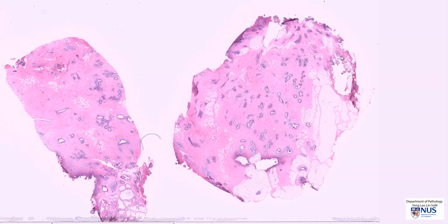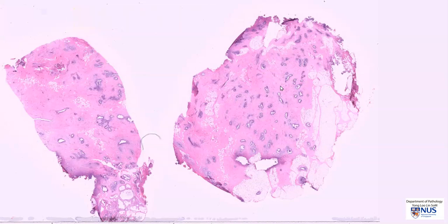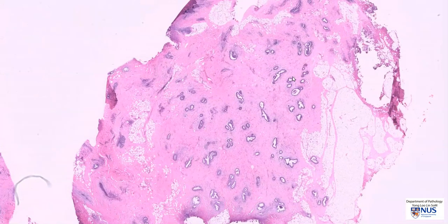This is a virtual microscopy slide from a case of gynecomastia, a lump in the male breast. At low magnification, we can see that there are both parenchymal or epithelial elements and stromal elements. The epithelial elements are composed of these ducts.